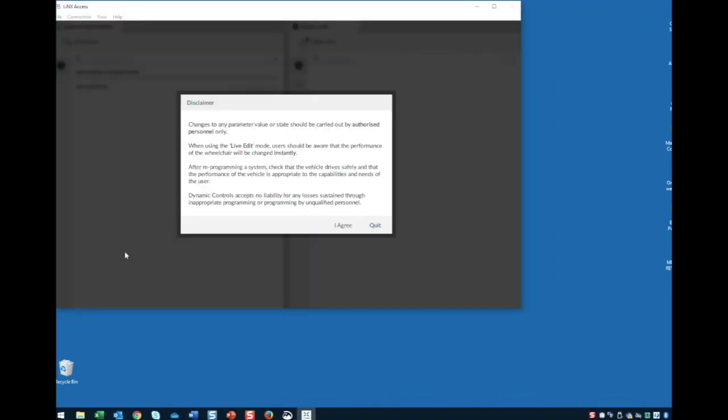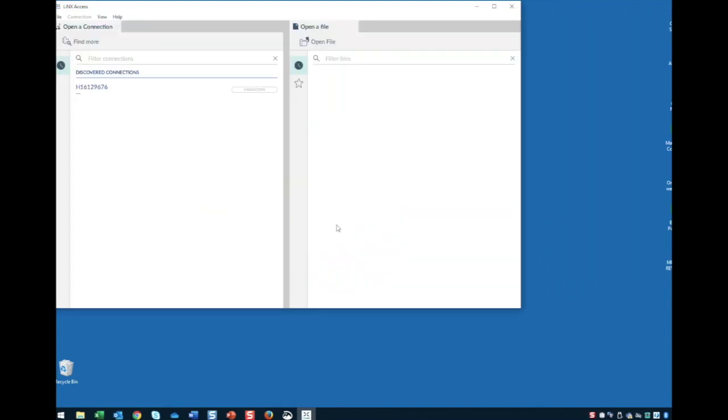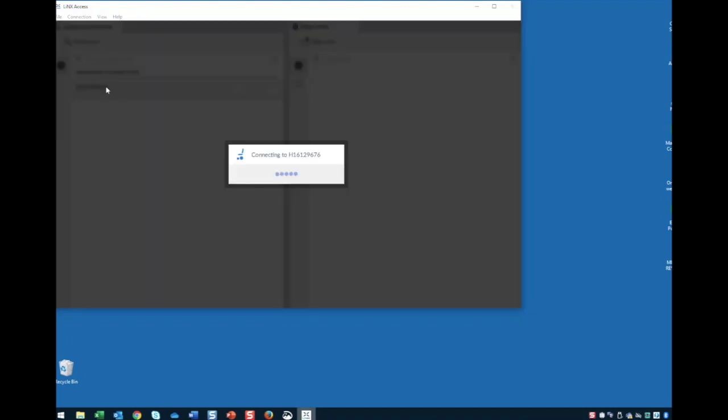After reading the disclaimer, tap I Agree. Under Discovered Connections, click on the LAC. Once again, unless it's renamed, the LAC will be identified via a serial number located on the back of the LAC.